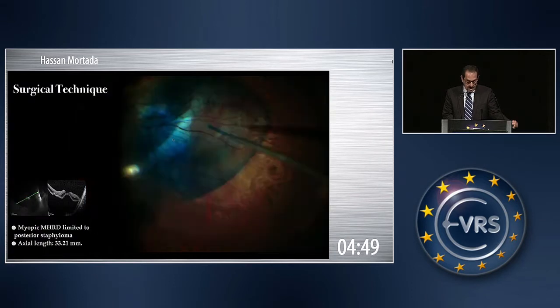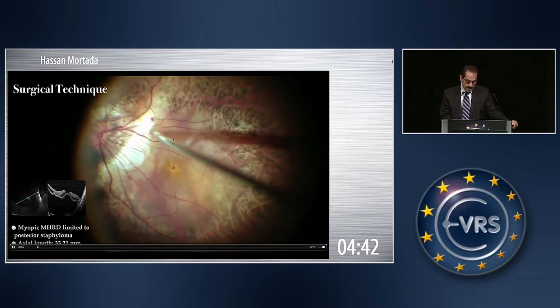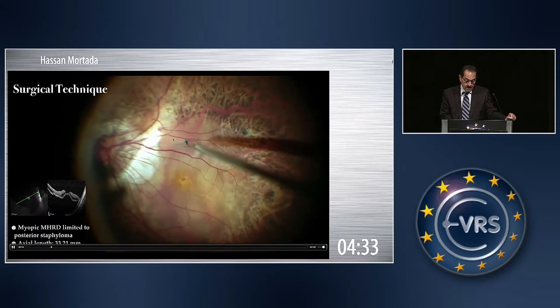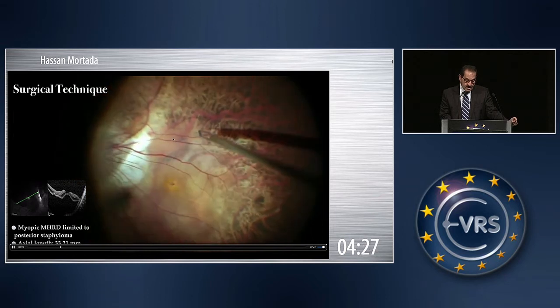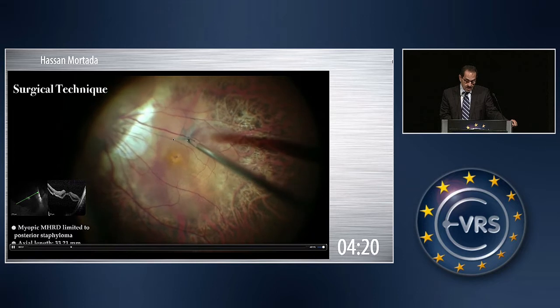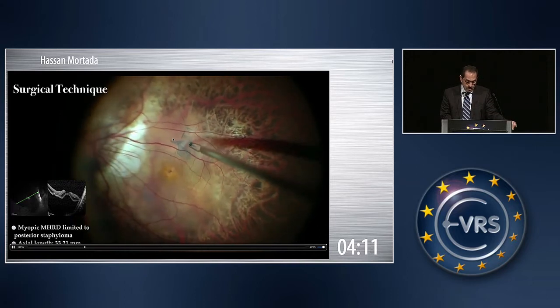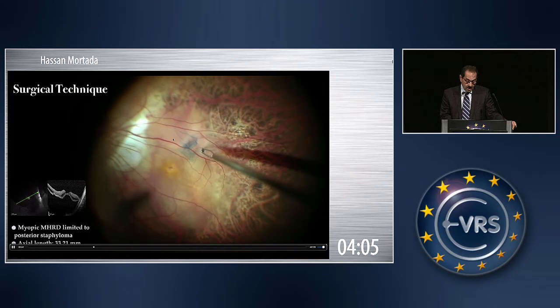Brilliant blue is injected, and I usually start by using the tanner scraper to create an edge, because it is difficult to grasp the ILM from the surface of the thin retina. All directions of peeling are towards the macular hole, and the idea is not to increase the size of the macular hole — either towards the hole or going around it in order to eliminate or decrease the possibility of enlarging the hole.